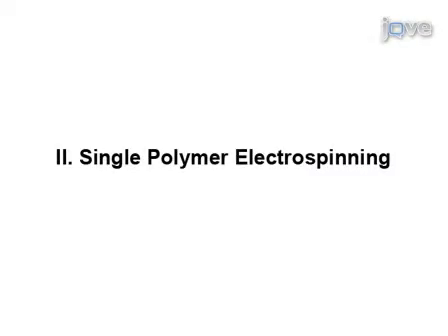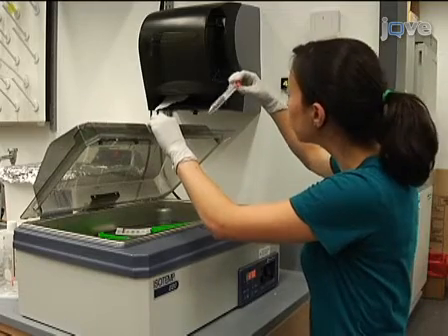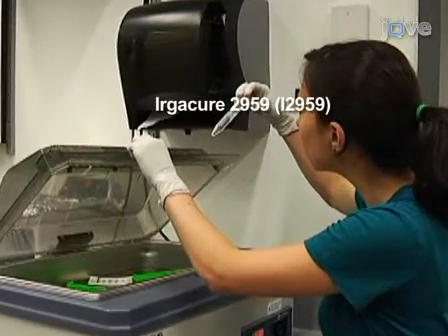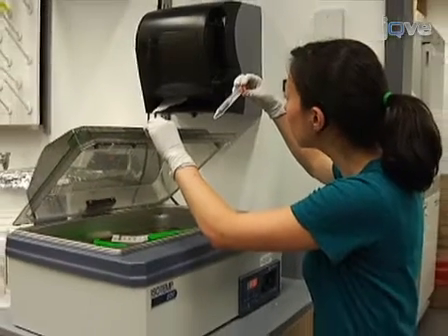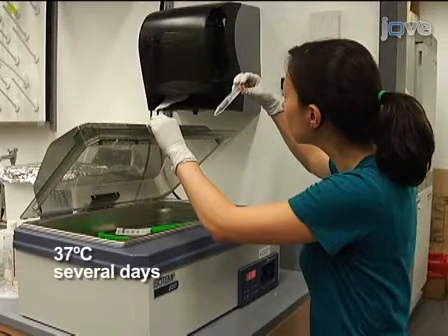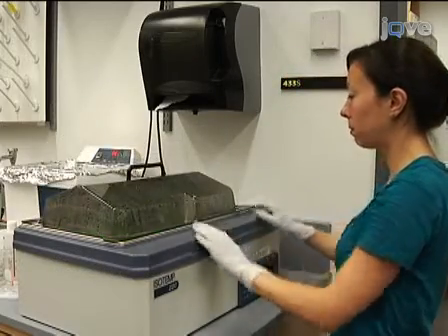So, let's get started. Prepare a 0.5% weight solution of the photoinitiator Irgacure 2959, or I-2959, in deionized water by dissolving at 37 degrees Celsius for several days. Irgacure is used if a photoreactive polymer is needed for electrospinning.